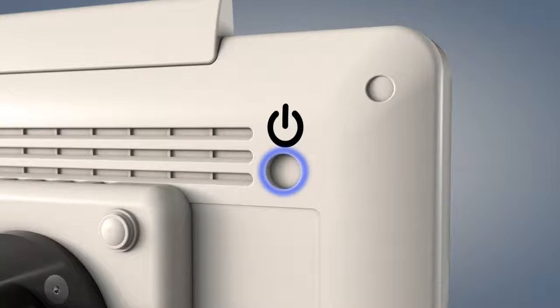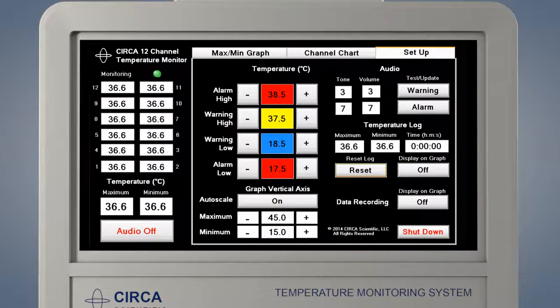Switch on the CERCA monitor by pressing the white power button located on the back of the monitor in the upper right corner. The program may take up to two minutes to start. When the monitor is first switched on, the setup screen will be displayed within two minutes. Assure that appropriate temperatures are shown on all 12 sensors.